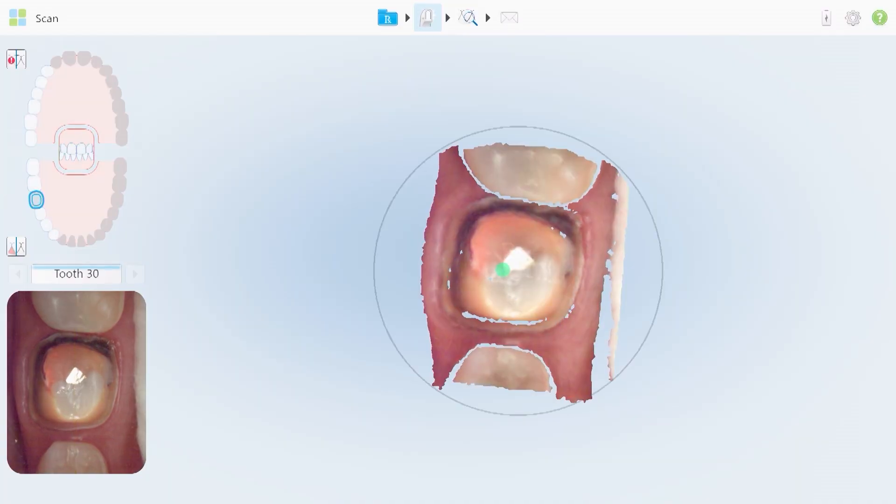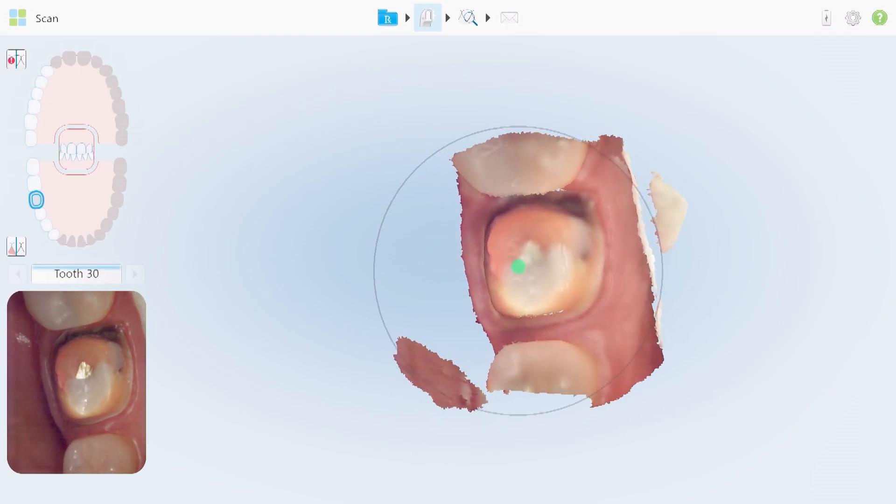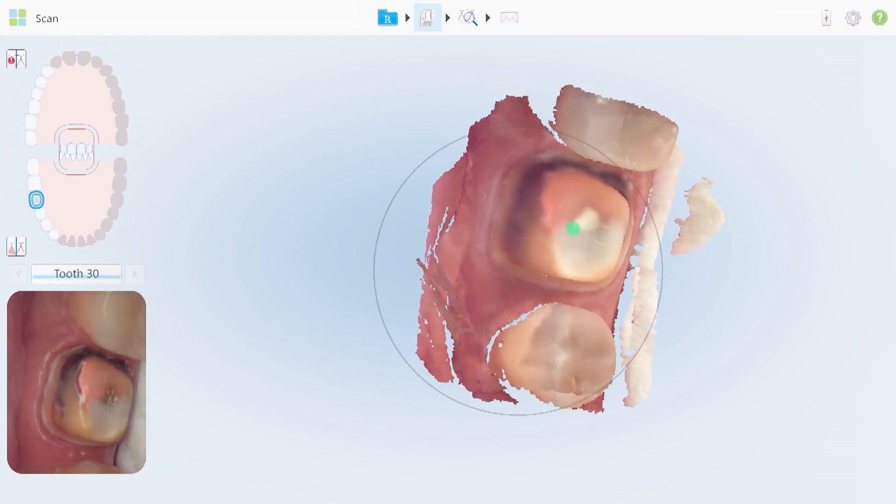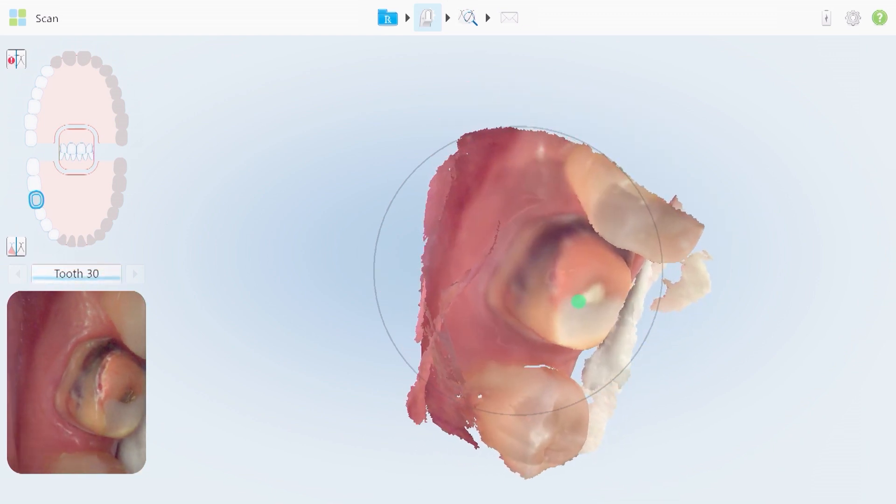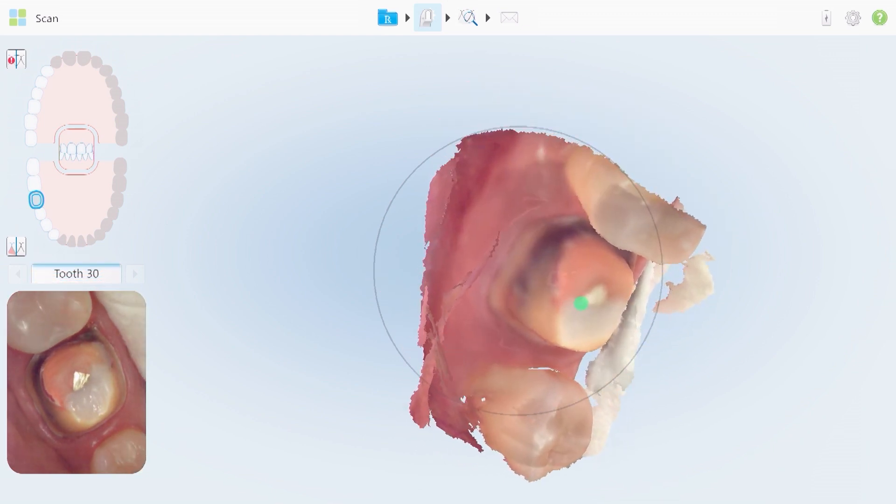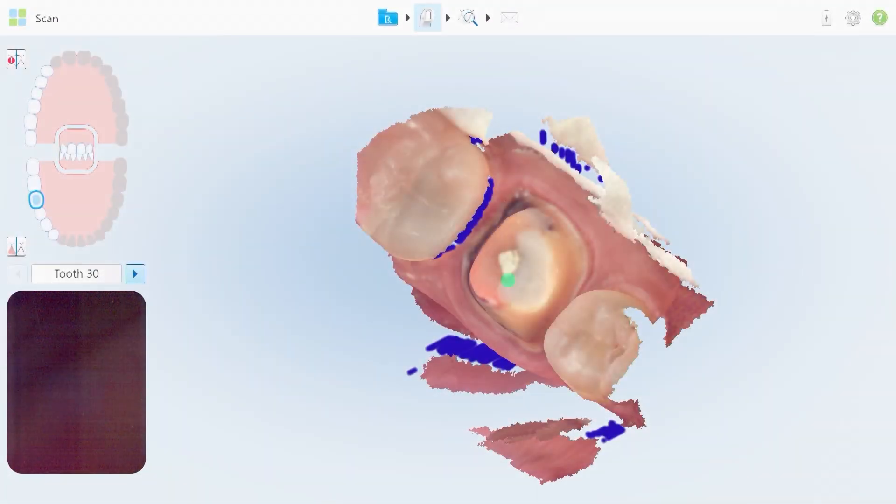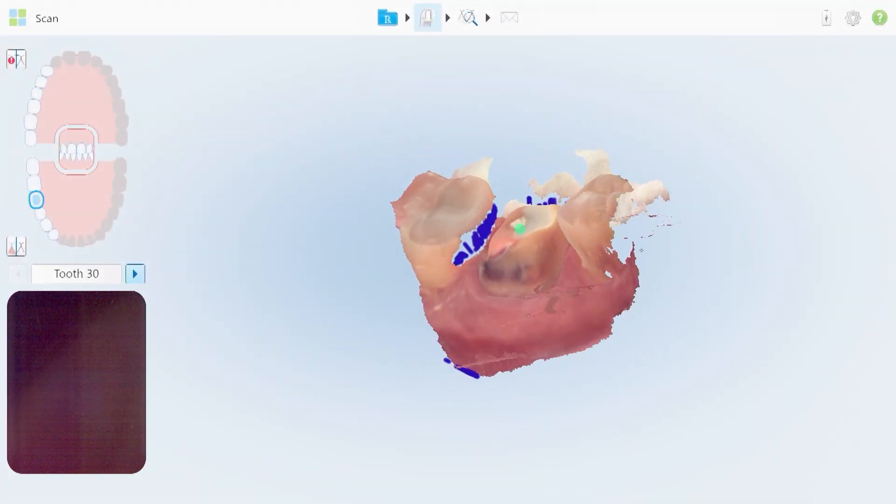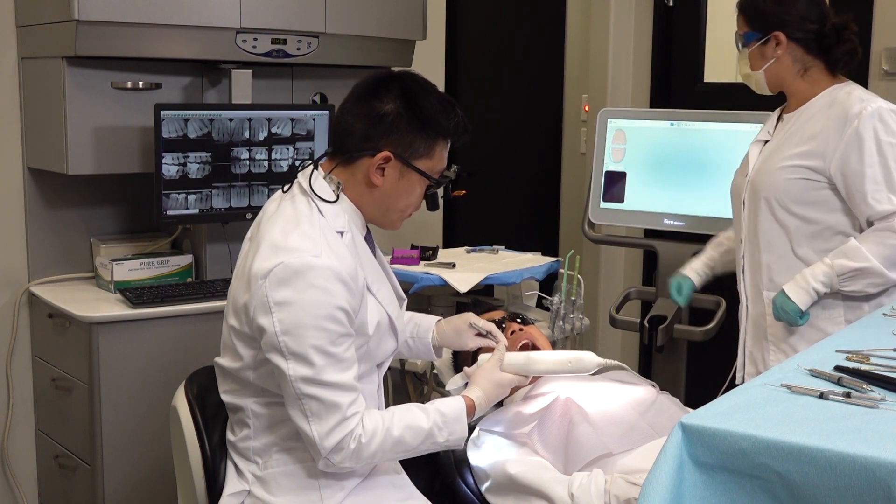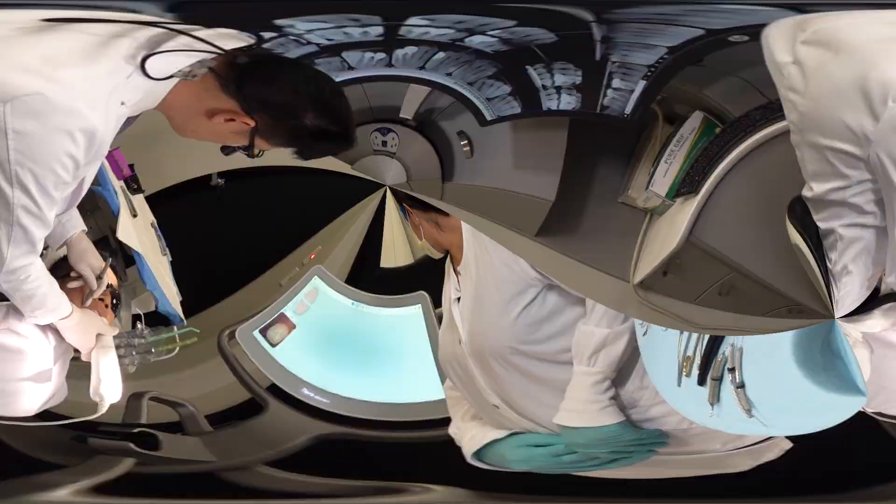I'll activate the camera over the preparation. In this case with the iTero Element, the first scan that we capture will be of the preparation. The more dry the area is, the easier the scanner will capture the site. Now we've captured the preparation and we'll move on to our quadrant scans.